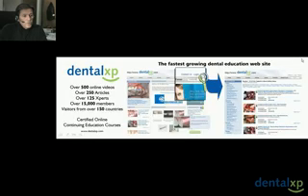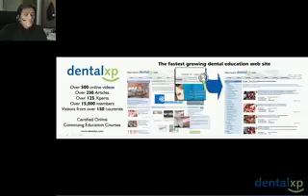As far as the 3 teeth are concerned, if an implant is one of the anchors for the tooth movement, then I think that 3 teeth are enough, because the implant is a suitable anchor for the tooth movement, especially extrusion. But if you're going to be utilizing natural teeth, then I believe that you should bracket at least 2 teeth on either side of the tooth that you're moving for optimal or at least suitable anchorage for tooth movement.